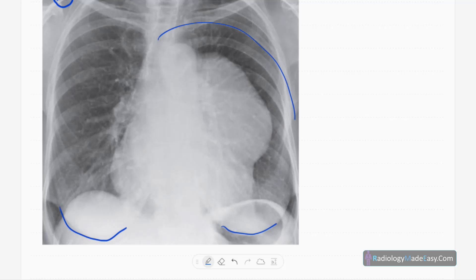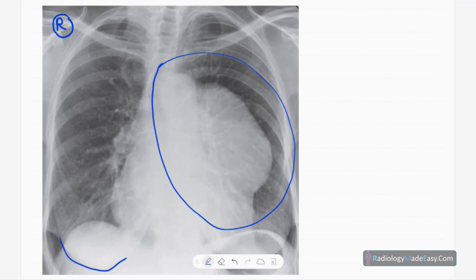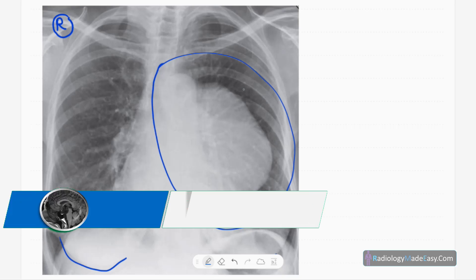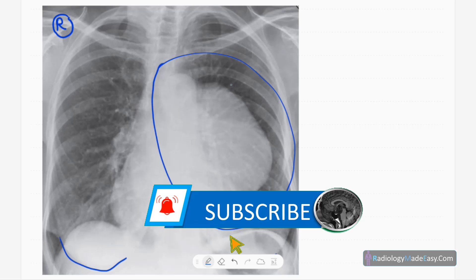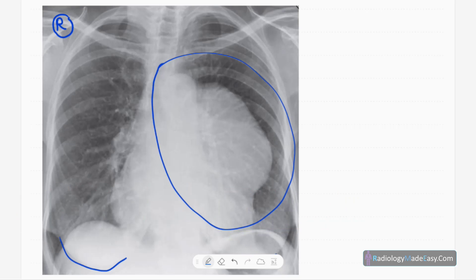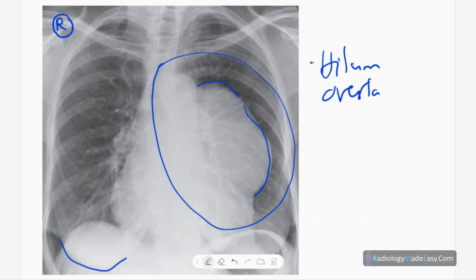There is an abnormality here: a large soft tissue density mass projected over the left mid zone with a slightly lobulated outline. The left heart border is obscured, and the medial margin merges with the mediastinum.